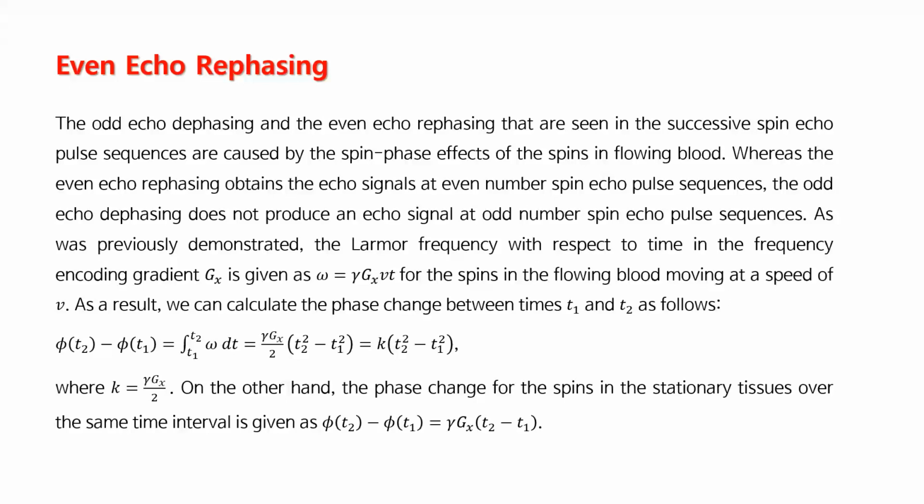So next, let's see the even echo rephasing. This is the effect of the phase difference between stationary and flowing blood.